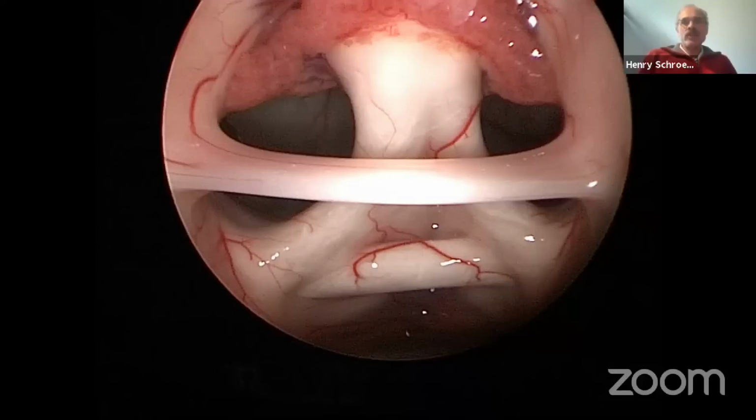Then I always use a 30-degree endoscope to check the prepontine cistern, to make sure that the basilar is exposed, and also to see if there are any additional membranes. The first layer is the floor, then we have the Liliequist membrane, but frequently you have multiple membranes further down, and these should be opened as well. Otherwise, you do not have the pulsatile CSF flow required for a successful ETV. But the 30-degree endoscope is mainly for inspection of the prepontine space.